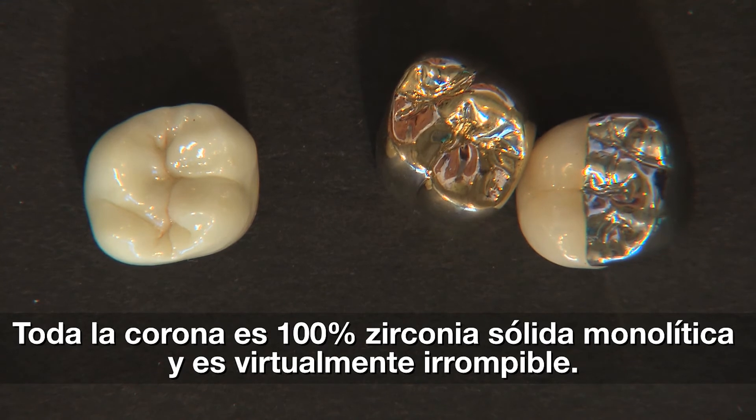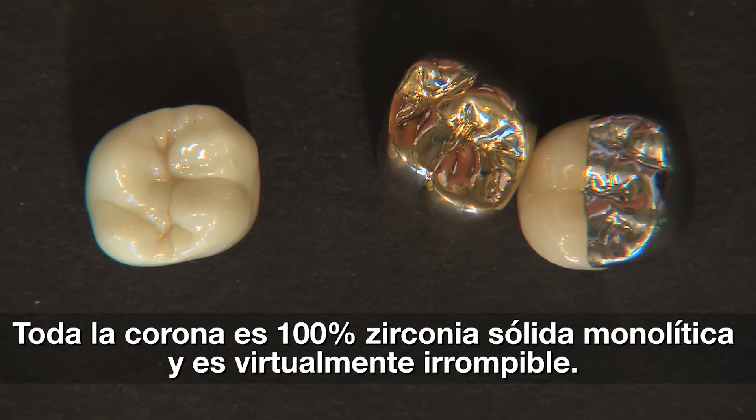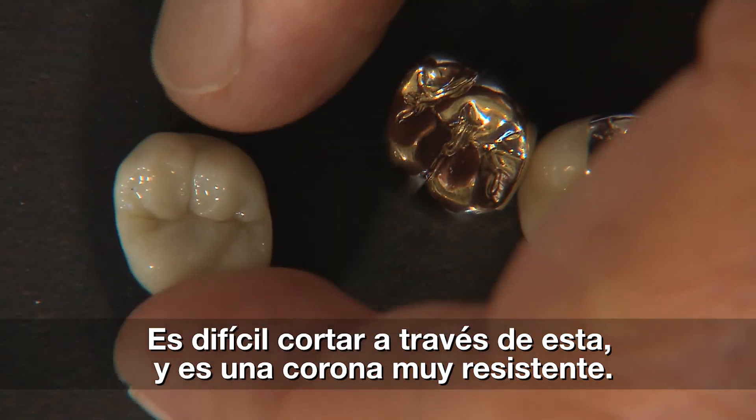This crown is virtually unbreakable — and that's how we talk about Bruxer — because it doesn't have any porcelain that can chip off. By the same token, it's a very robust material. As you'll see when you try to take off your first zirconia-based restoration, it's very difficult to cut through. This is a strong, strong crown.